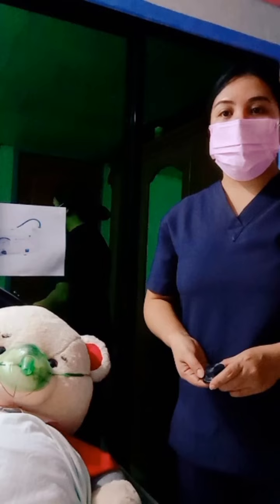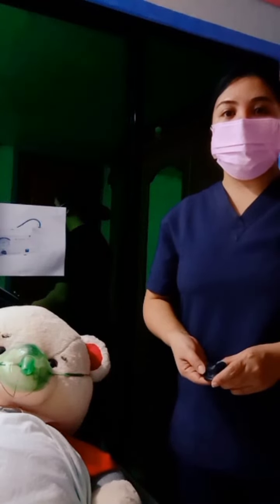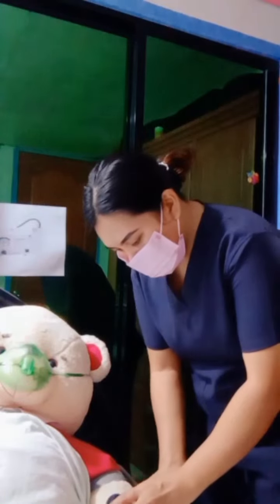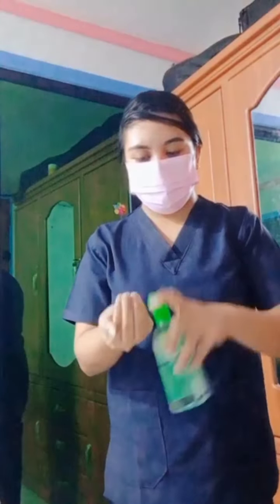Place a pulse oximeter on the patient's finger and leave the device in place. Next, you need to do hand hygiene. And put PPE as indicated.